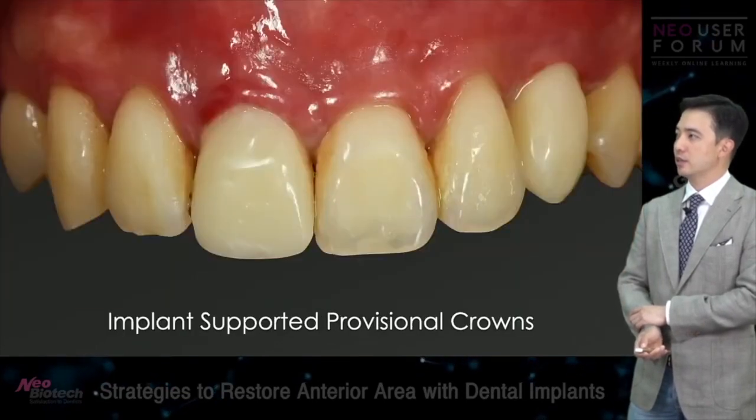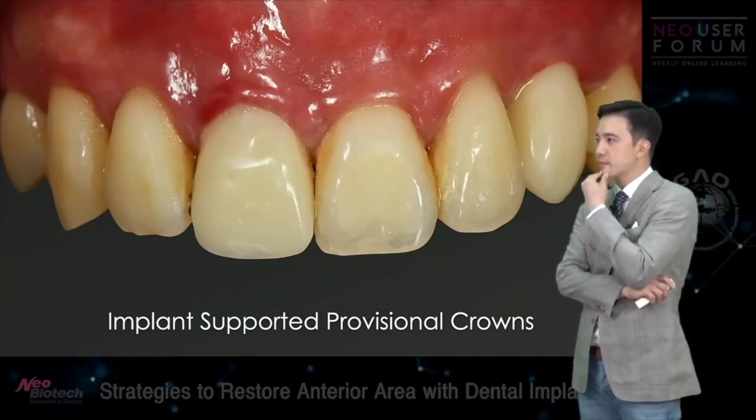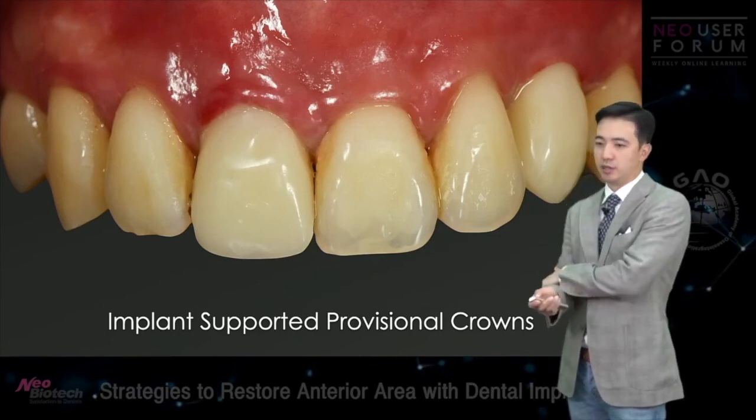For this case, implant-supported provisional crowns were also delivered.